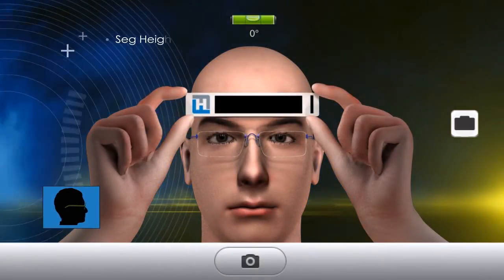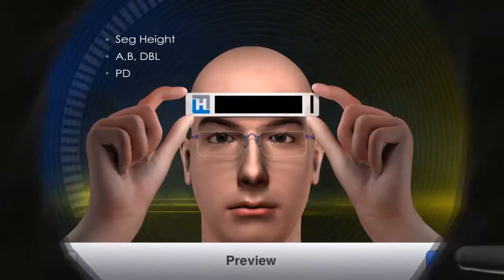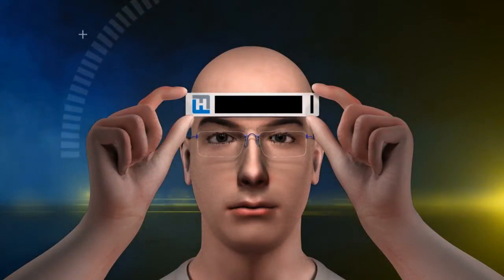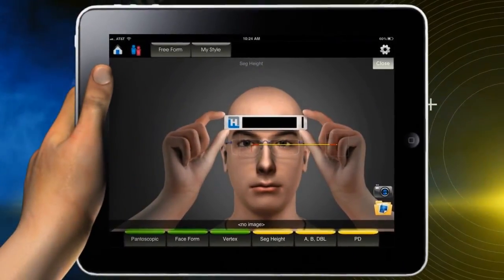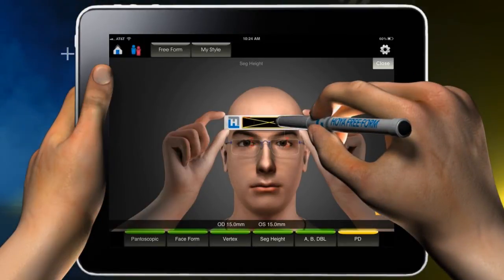Use the shadow button if necessary and snap the photo. Once you become familiar with the positioning, you do not have to use the shadow button. It's there as an option to help you position the patient. Tap the large black box to lock on. A yellow X will appear in the box.